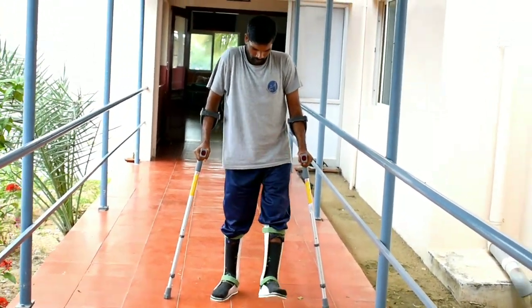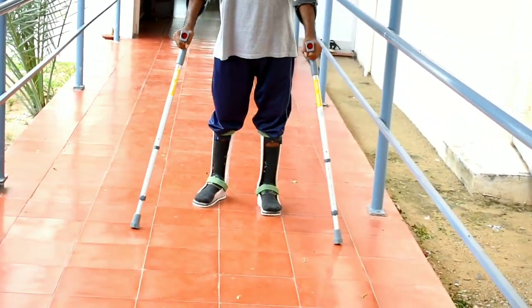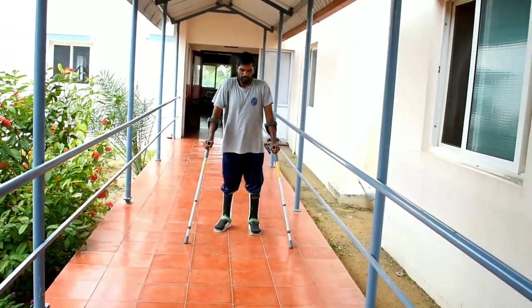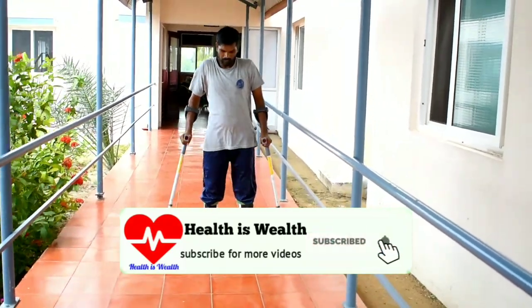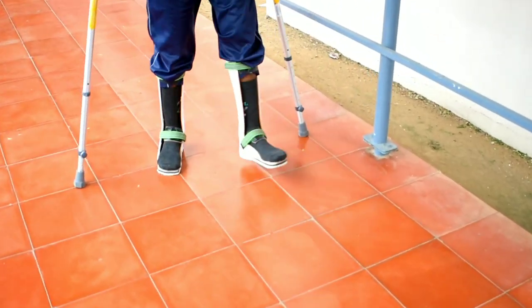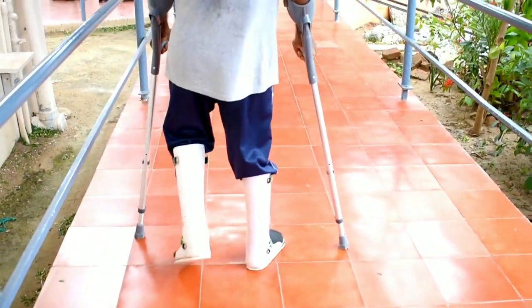In his condition, he has good power in his right leg and fair power in the left lower limb. That's why when he steps on the right side it is controlled and he achieves a heel pattern, but on the left side he swings it through because with fair quadriceps power he uses his hip muscles to move forward and lock the knee with force. You can see this is a type of four-point gait where he uses elbow crutches and legs in a different manner.